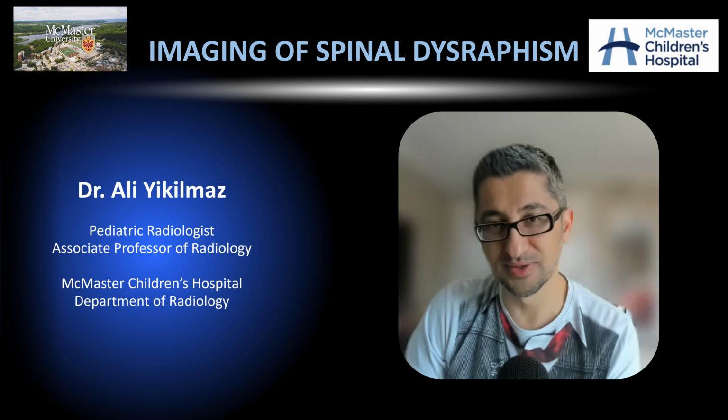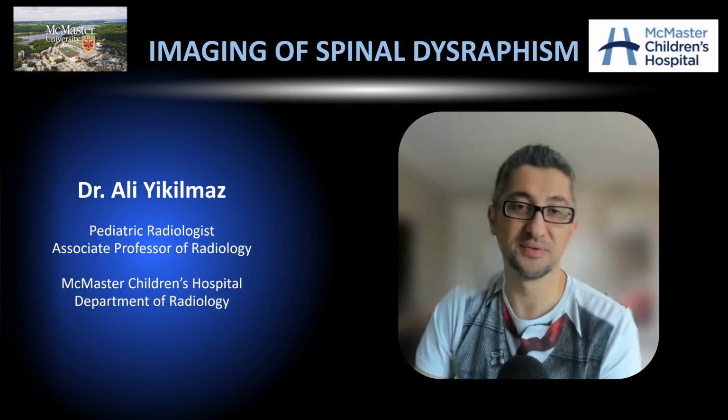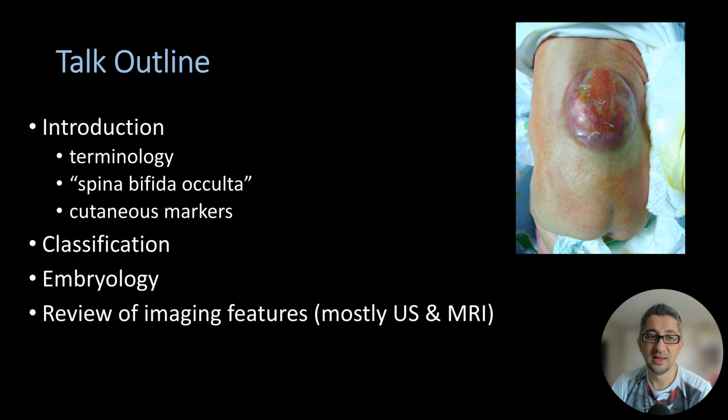I'm a pediatric radiologist at McMaster Children's Hospital, and I'm going to talk about imaging of spinal dysraphism. After the introduction, I'm going to talk about the classification, then embryology, then review the imaging features, mostly of ultrasound and MRI.